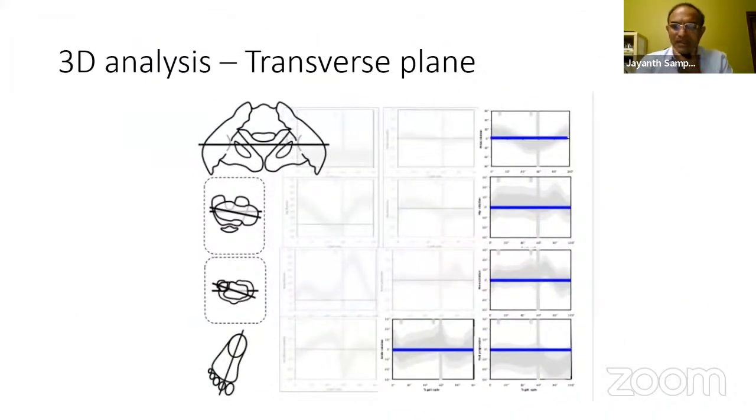Can I just say something very simply? Please. We are always trying to work out mechanisms by which people who don't have a gait lab can appreciate the pelvic rotation. One very simple way to do it is to put two markers on the ASIS. Normally, when we walk, from a properly taken side video, you will not be able to see the marker on the other side.